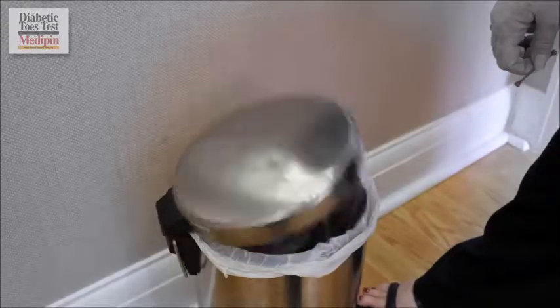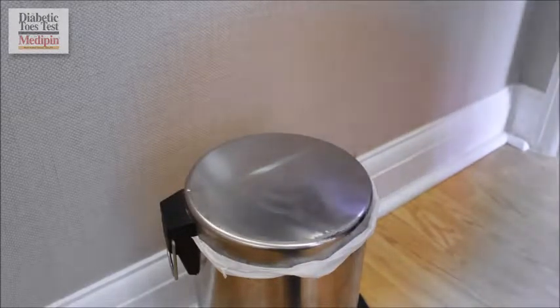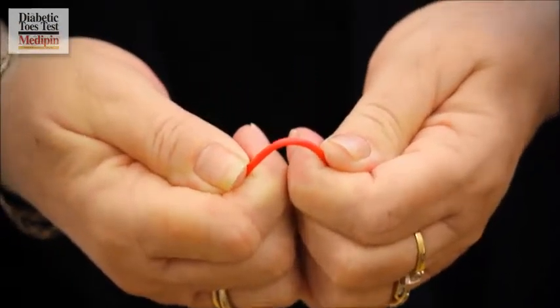Medipin has no metal parts and is designed to allow the point to flatten down without breaking off. Then you can throw everything, including the tab, away. To be extra confident, you may even snap the Medipin in two.